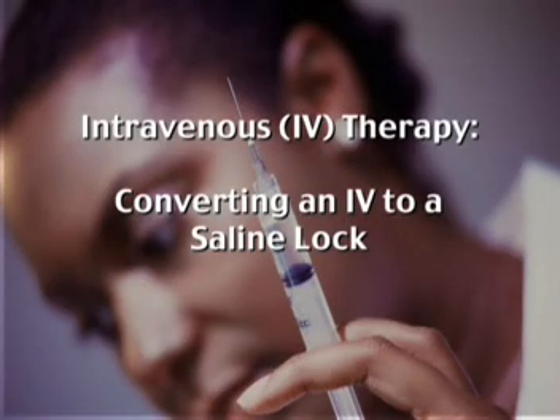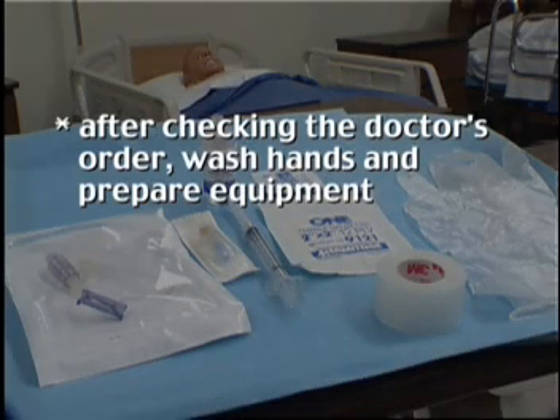Converting an IV to a saline lock. After checking the doctor's order, wash hands and prepare equipment.